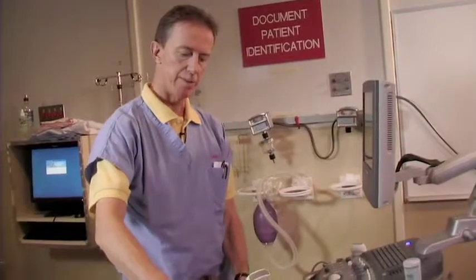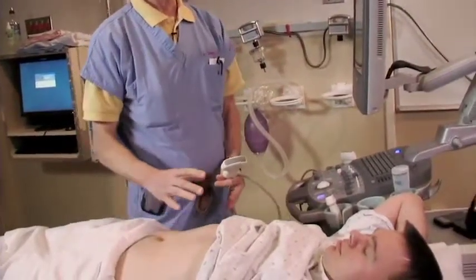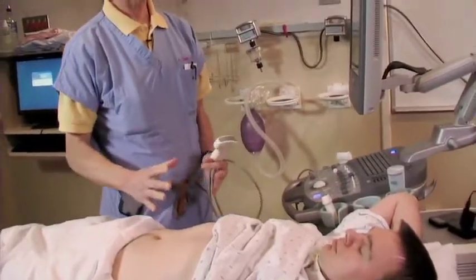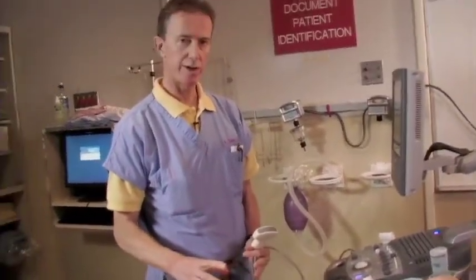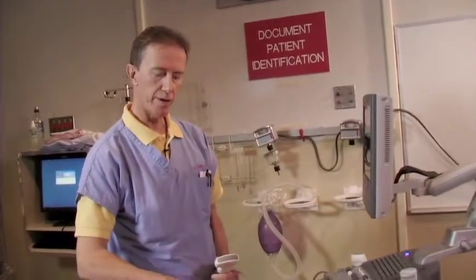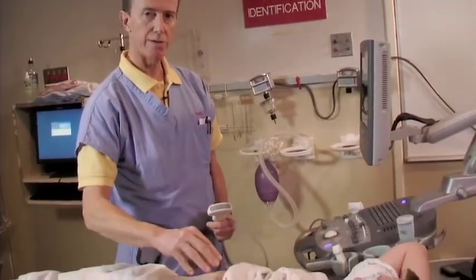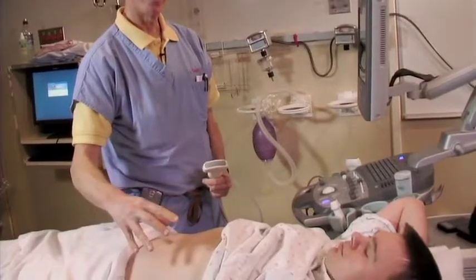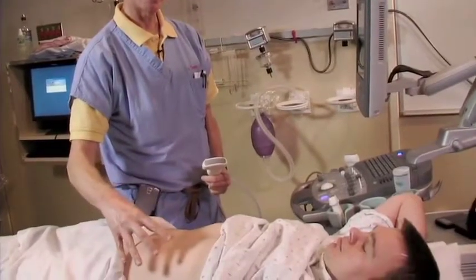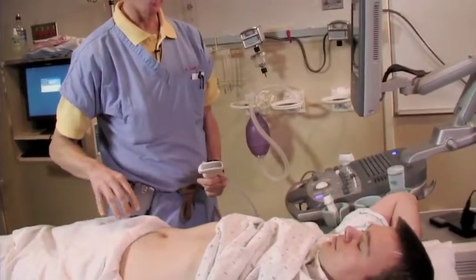As a preview, there are going to be 10 potential spaces that we are going to evaluate. They are four in the right upper quadrant, one in the sub-xiphoid area, four in the left upper quadrant, and one in the suprapubic area.